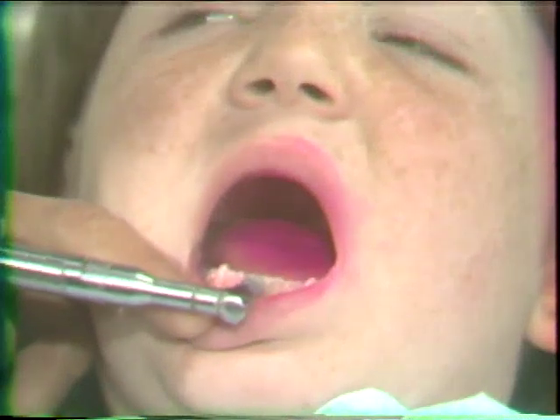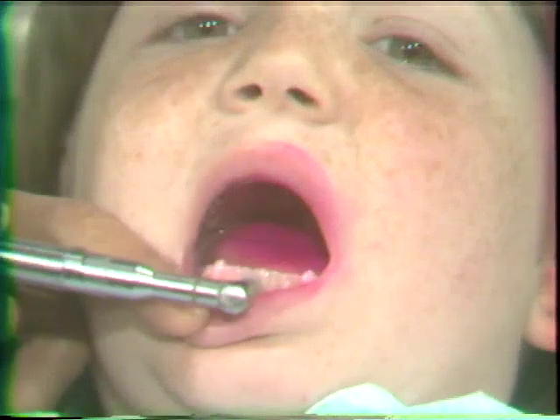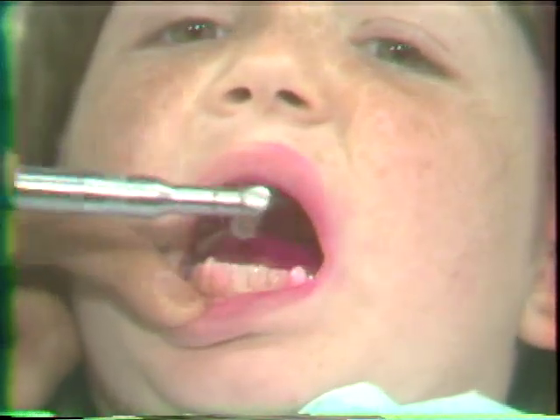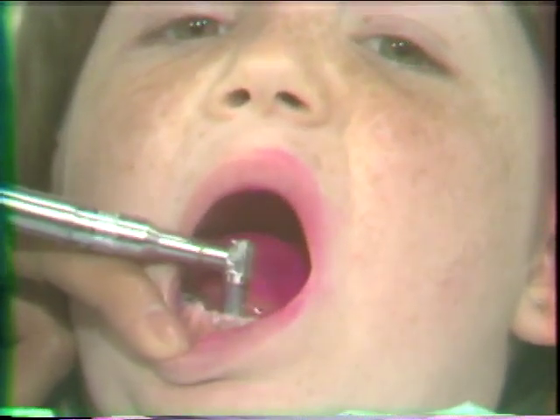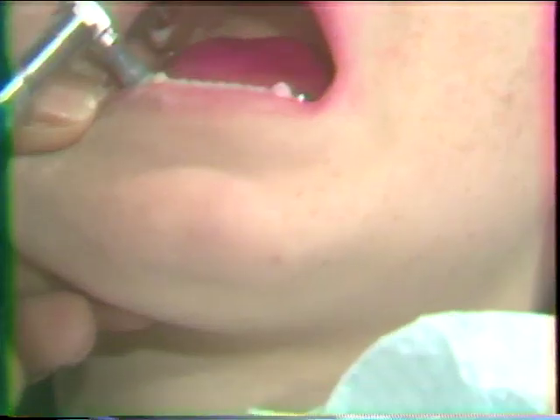With gentle pressure, the prophylaxis cup should be placed under the buccal or facial free gingival margin. Keep in mind that the depth of the gingival sulcus in a child is 2.1 millimeters plus or minus 0.2.